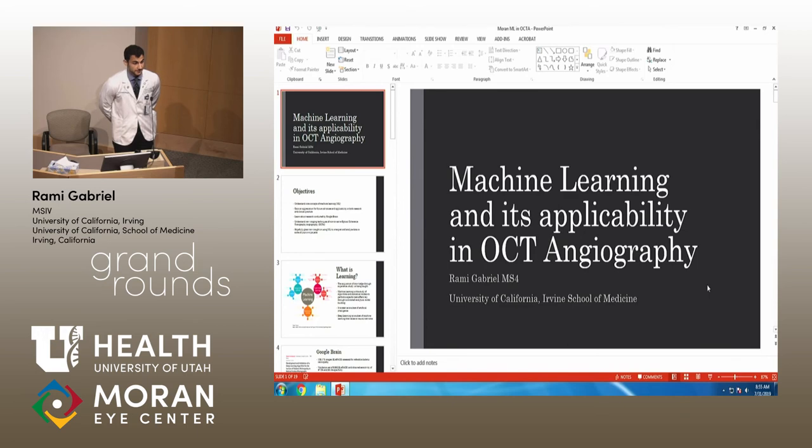I mean, already we're talking about a project now in which we're going to use this program because, frankly, for diabetics, one of our biggest problems is they're just not getting screened. Right. And the best time to catch it is when they see their primary care physician and a picture is taken and AI looks at it, and it says, you need to be seen. That's where the sensitivity is really strong. Not classifying it, but making sure that all those people get in and get seen when it says that there is retinopathy. Because like I said, the sensitivity, as you said, was like 96%, 97%. Right. I think those are the kinds of things we'll see as extremely important in our future. Absolutely.